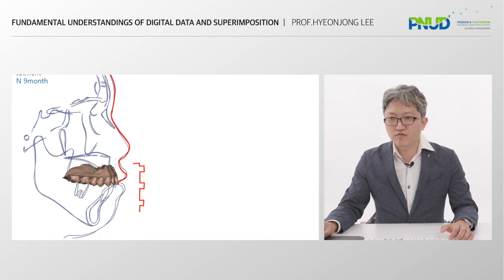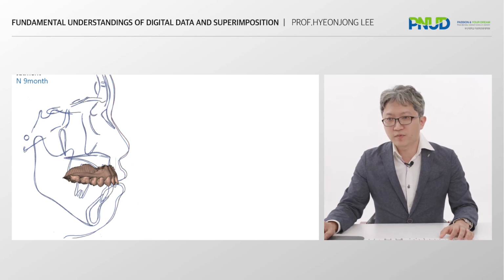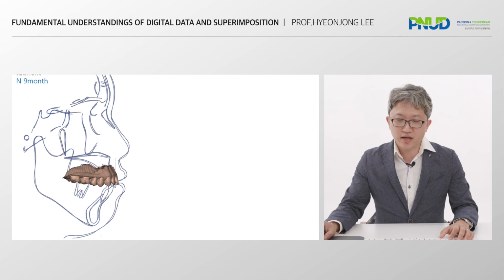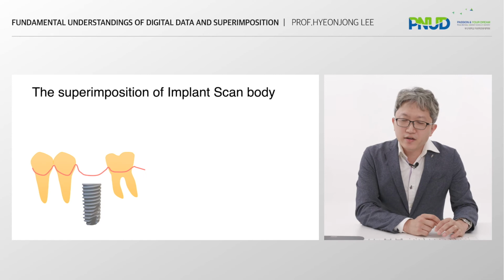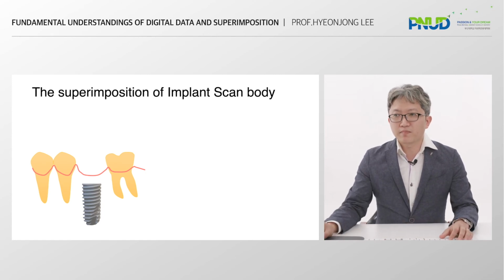After that, we can just remove this frame. Then we obtain the upper model and facial surface, well aligned, and it now has information for diagnosis.